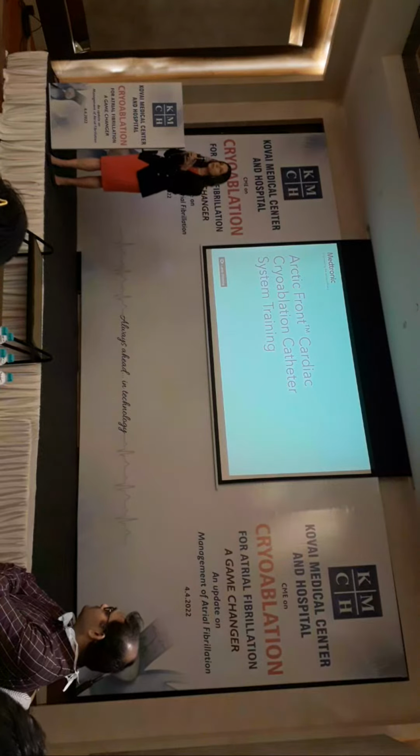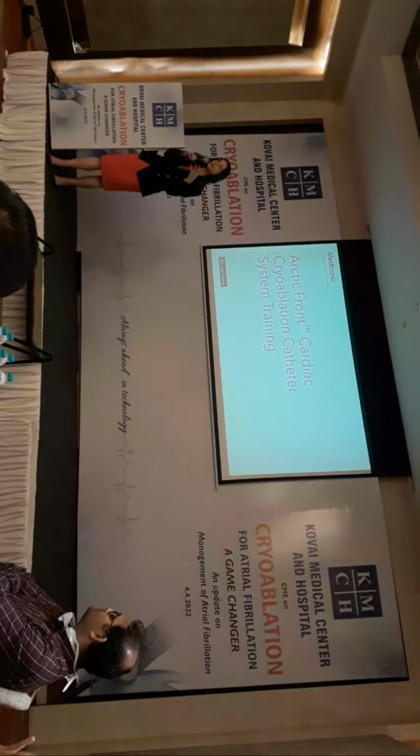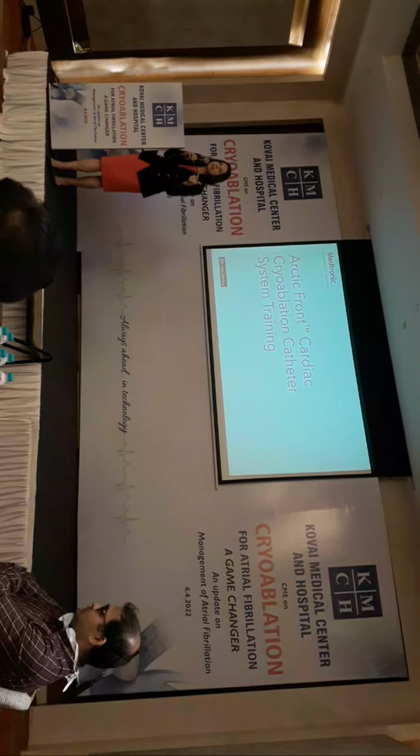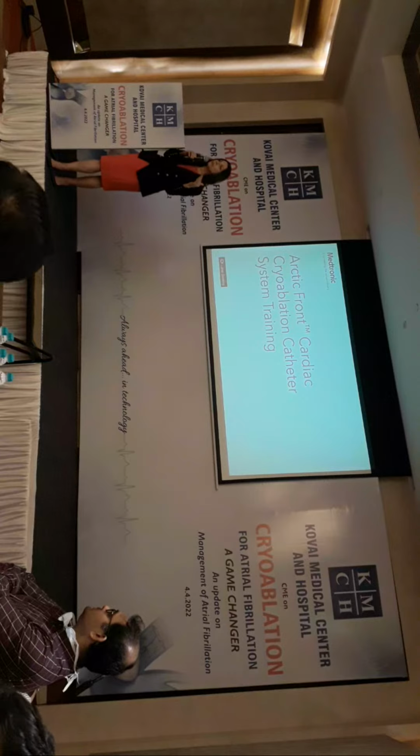But if we look at those patients with the more normal, quote, sized atrium and true PAF, the results are even better. So we've always had naysayers in this area. Now it's just harder to refute it. Plus the technology is good, the safety is up. I'll bet the safety is even greater now because we have so many ways of watching things.